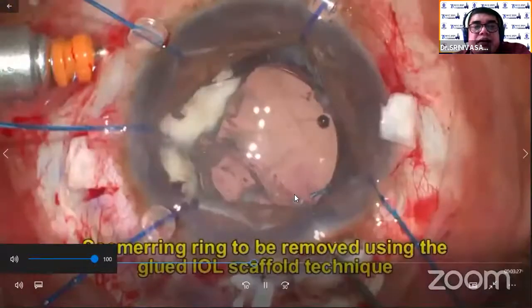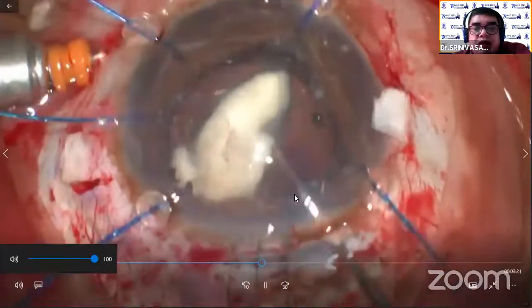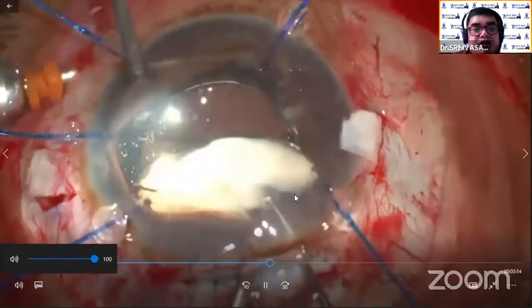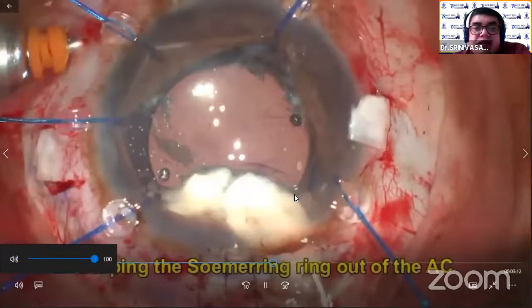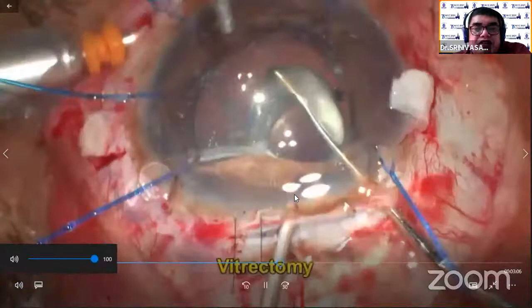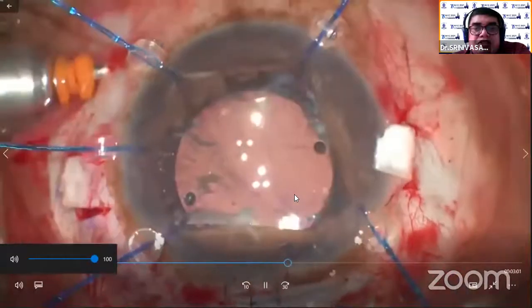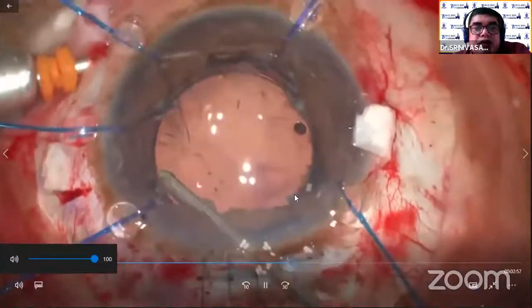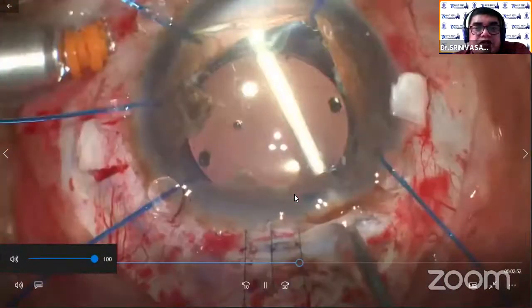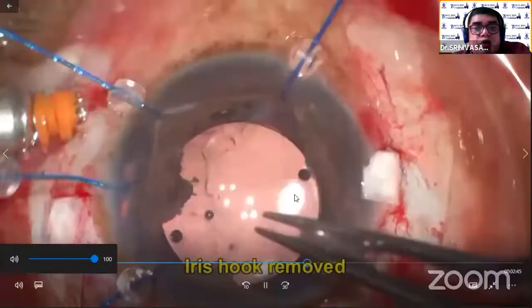Now the iris hook is inserted and separated, and the Soemmering's ring which is dislodged is brought to the main port. This Soemmering's ring removal is very essential because it will produce continuous opacification, intraocular pressure, PAS, peripheral and intraocular — all these things. Remove that slowly, or you can use a retractor if necessary. Gently remove that. In all these situations, we always use an endoilluminator. Again, miotic is done to create easy maneuverable movement of our instruments. Now by removing the Soemmering's ring — remember I kept the glued IOL as a scaffolding — gently the iris hooks are removed one by one.